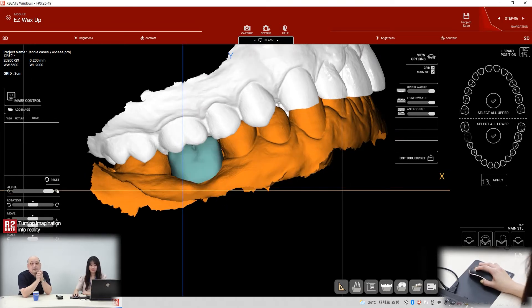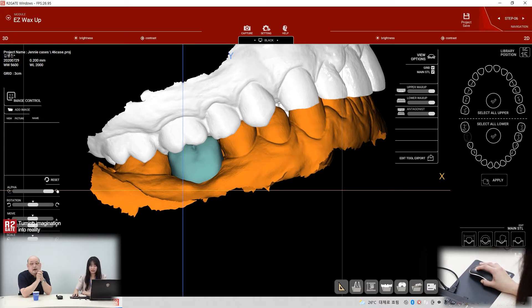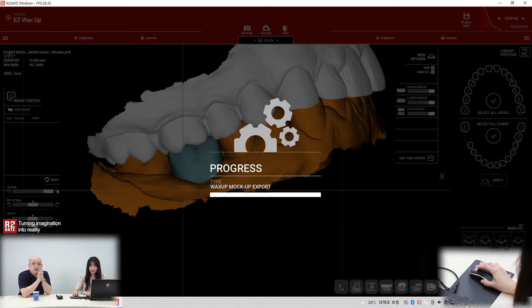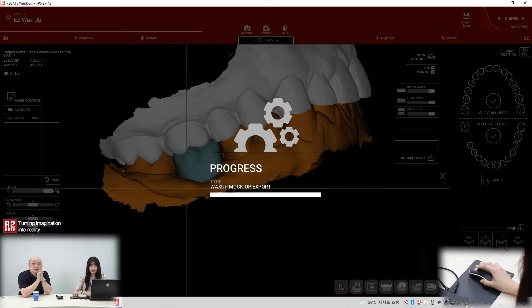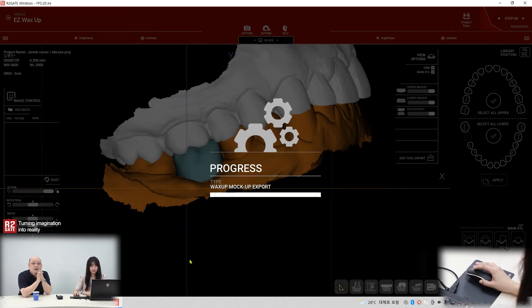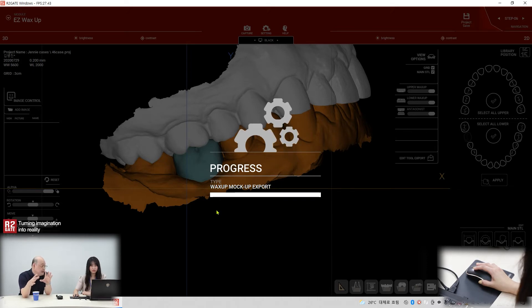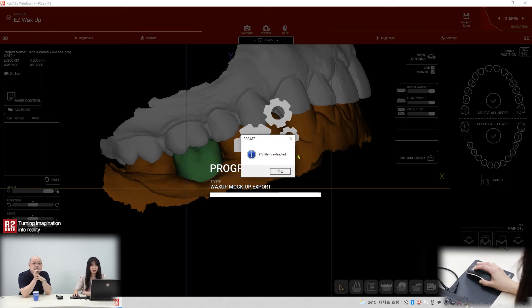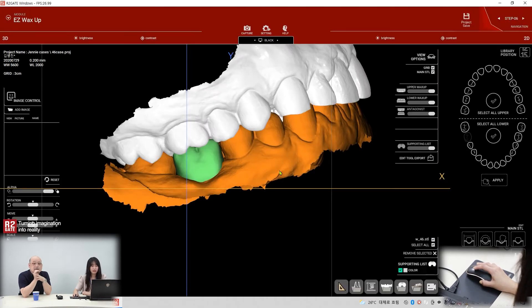And then save the wax ups. Wax up, export — that means you can export those teeth to the STL files. Okay, it's done.